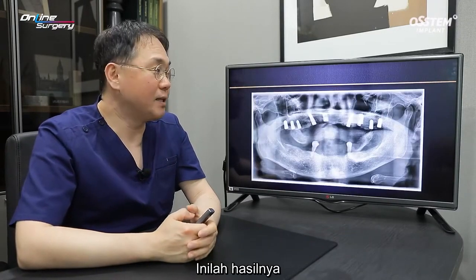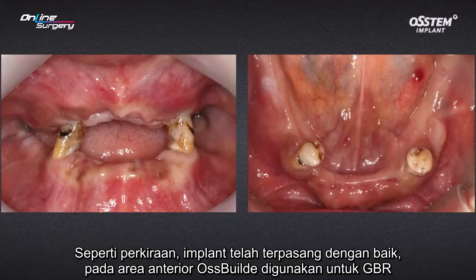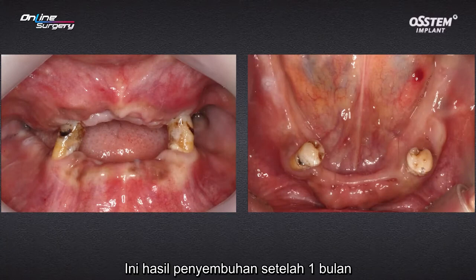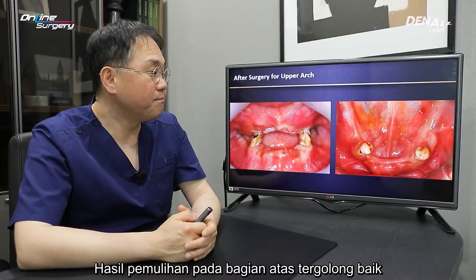This is the result. As anticipated, the implants have been placed nicely in the anterior area. Osbuilder was used for GBR. In order to have a bit of soft tissue healing, I waited for about a month. And this is healing after 1 month. Healing is nicely done in the upper.